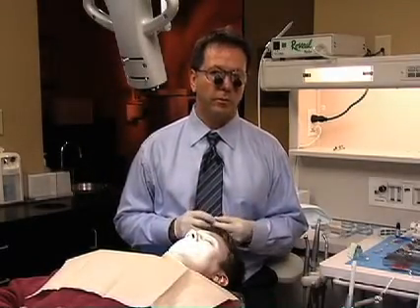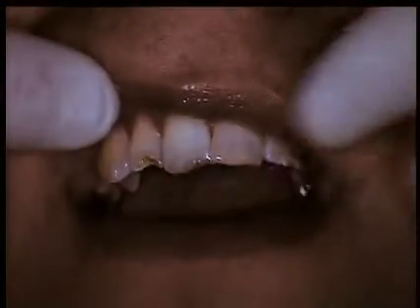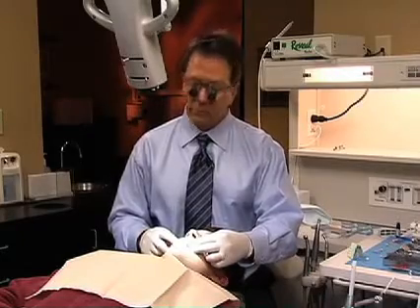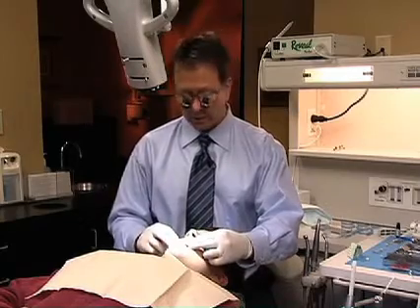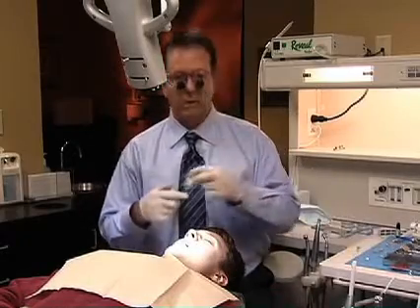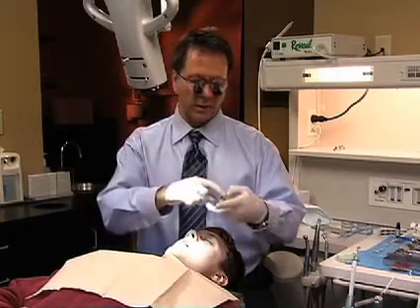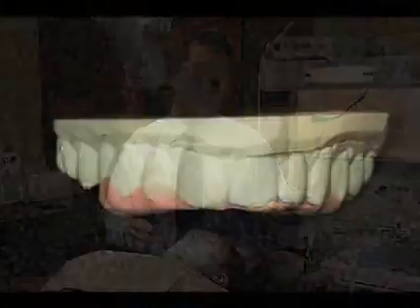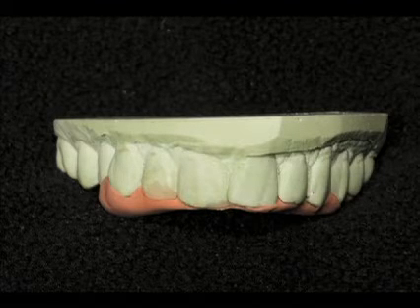When Daniel came in a couple of days ago, he was missing several incisal edges due to decay and several other things. So while he was here, we took a quick impression of his teeth. From that impression, I quickly waxed up a contour in the back that would be acceptable for us to use as a matrix. From that wax-up, I took the AquaSeal Easy Mix Putty and made a matrix of the new incisal edge position.